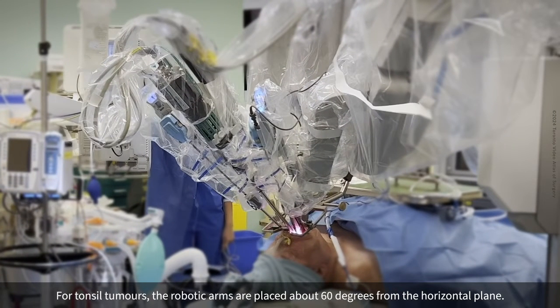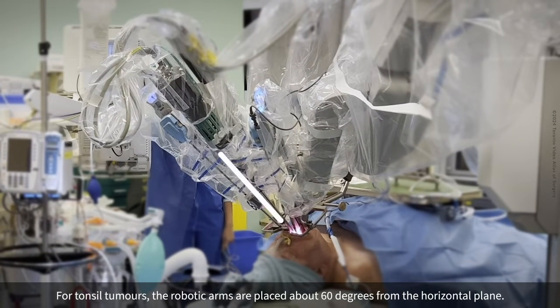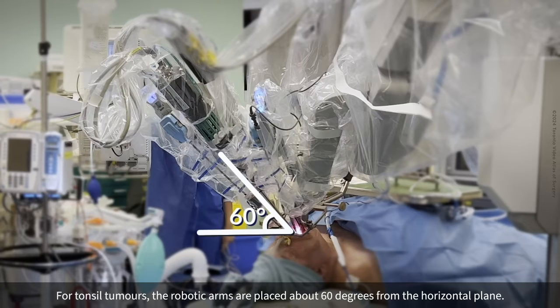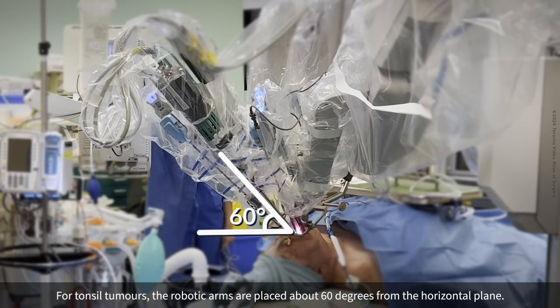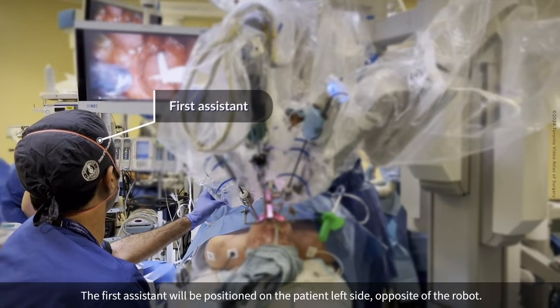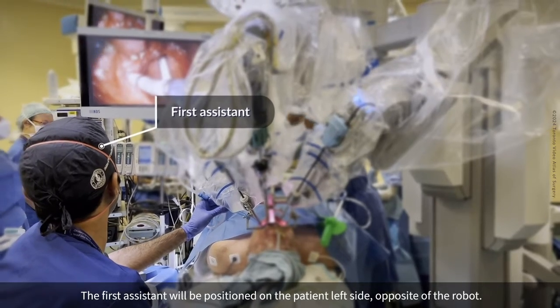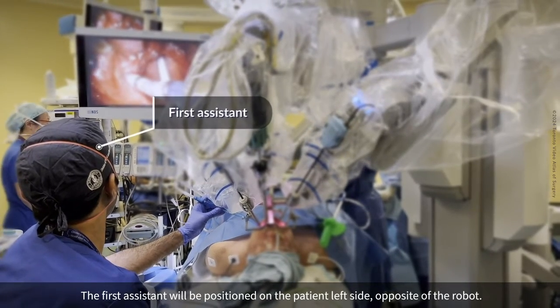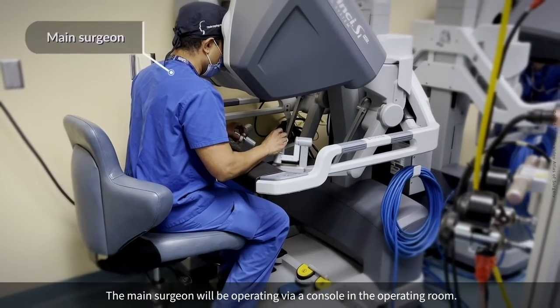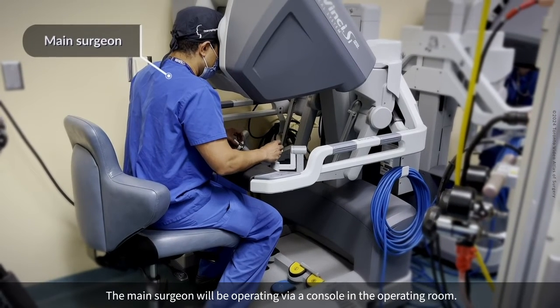For tonsil tumors, the robotic arms are placed about 60 degrees from the horizontal plane. The first assistant will be positioned on the patient's left side, opposite the robot. The main surgeon will be operating via a console in the operating room.